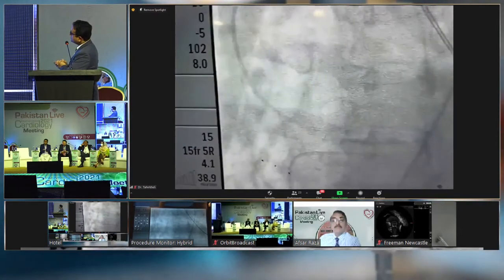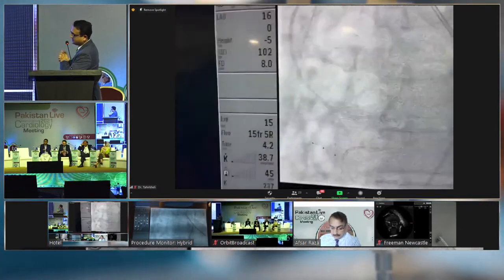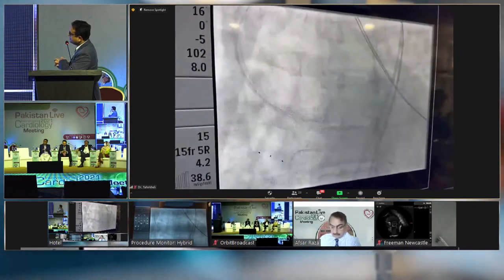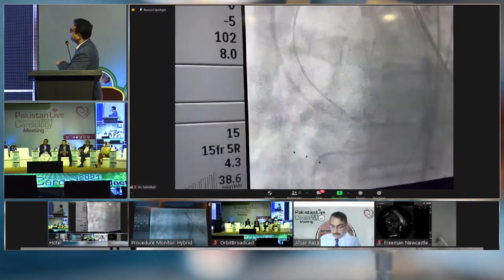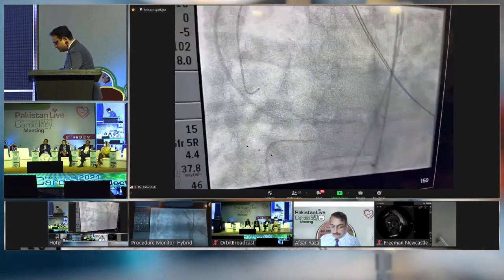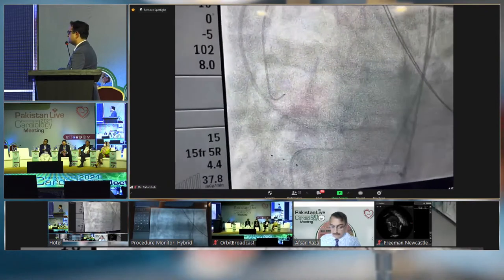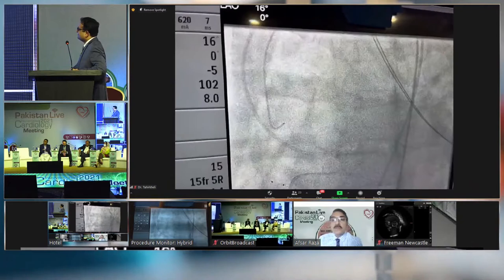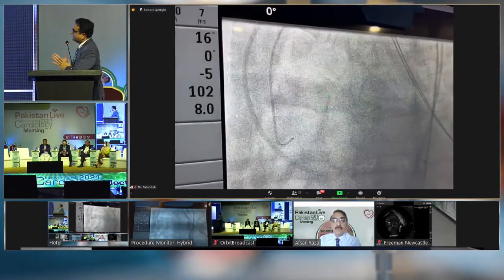Sorry, I have one more question. In Pakistan, we have started adopting this cusp overlap technique just because of the cost issues with pacemakers. What are your takes on that? Do you use cusp overlap for the right-left overlap, or do you go with the traditional way? We are still doing the traditional way. For people who are not familiar with this overlap technique, historically we have done 80-20 or 90-10, making sure that 90% of the valve is appearing above the annulus and 10% below.